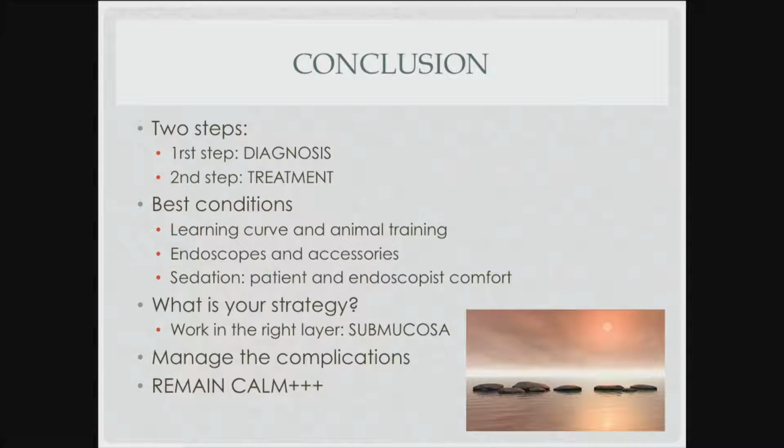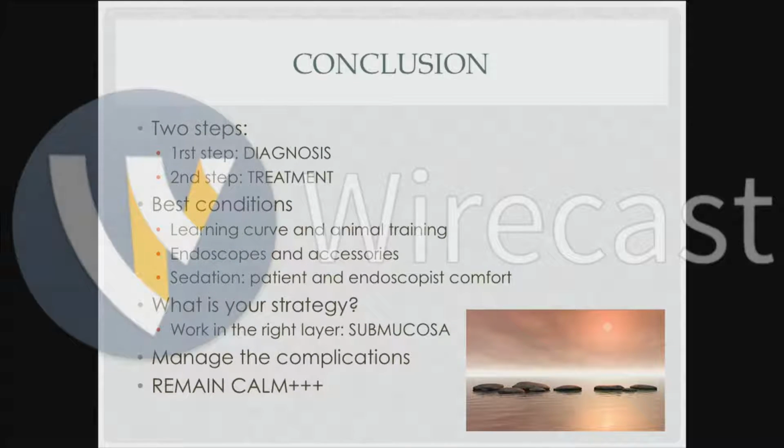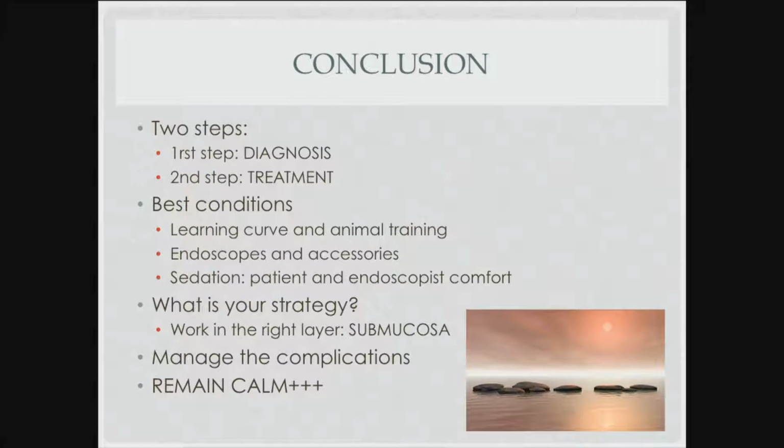Thank you, Gabriel. It was excellent. Any questions? Yes, thank you. I just want to ask you about the learning curve. For centers that may not have as many suitable patients that need ESD techniques, what do you think would be the minimum number that the procedurist needs to undergo to be competent? And then subsequently, what will be the number for maintenance of the competency?